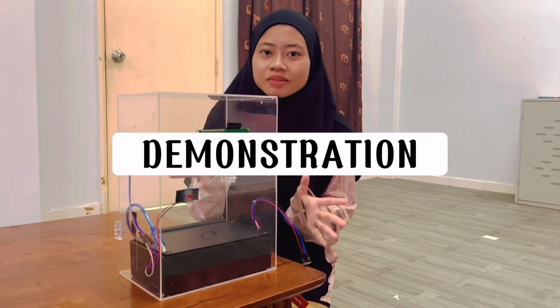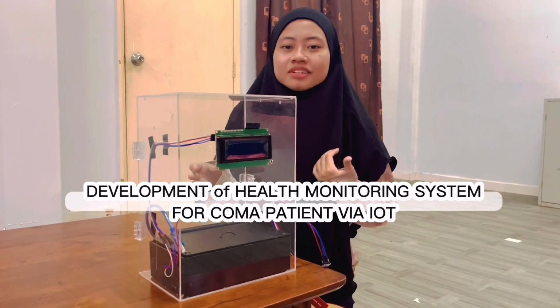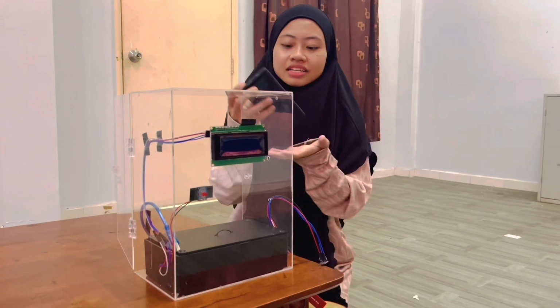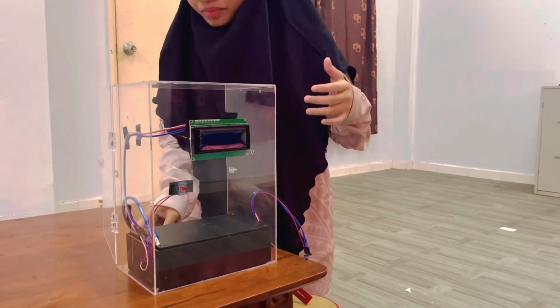Hi, this is our final year project, which is the development of a health monitoring system for coma patients via IoT. We use a power bank as the supply for this project.